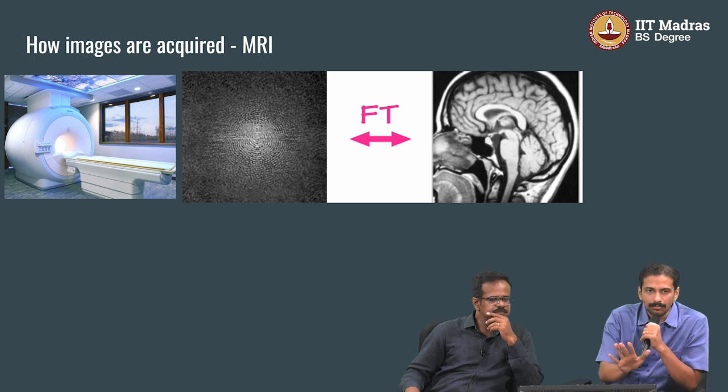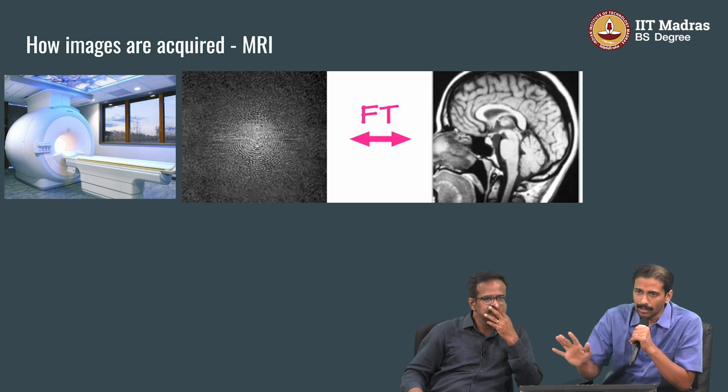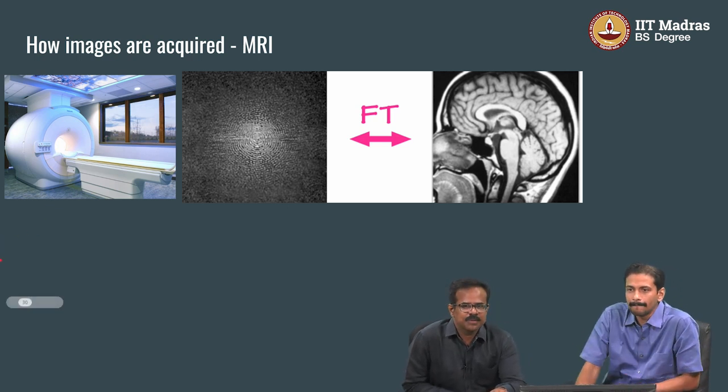All right. Coming to the last modality, MRI. MRI is again a very different modality. It's not based on X-rays. It's not based on sound. It is based on magnetism. So can somebody expand what is MRI?